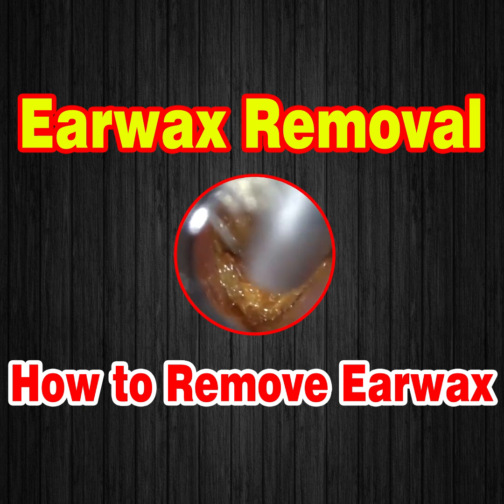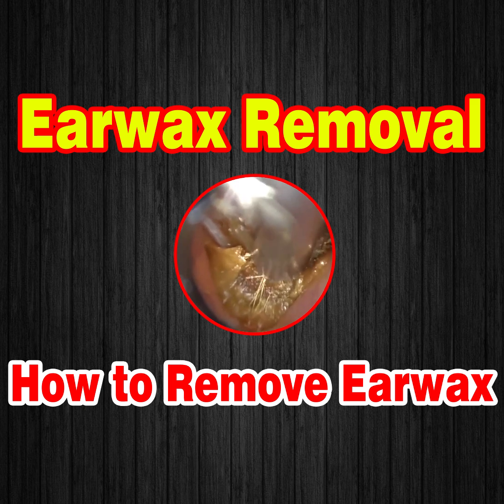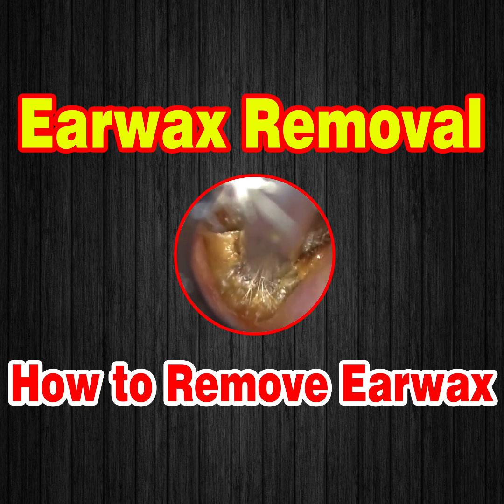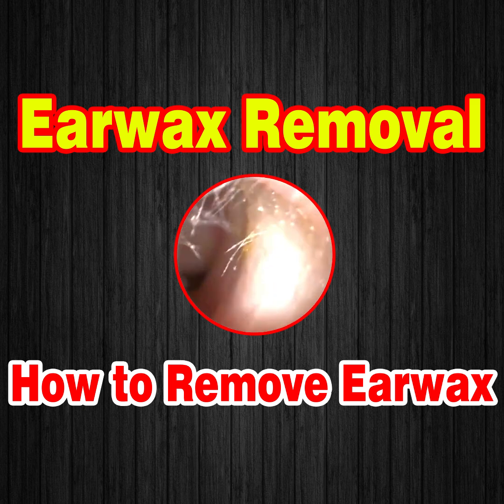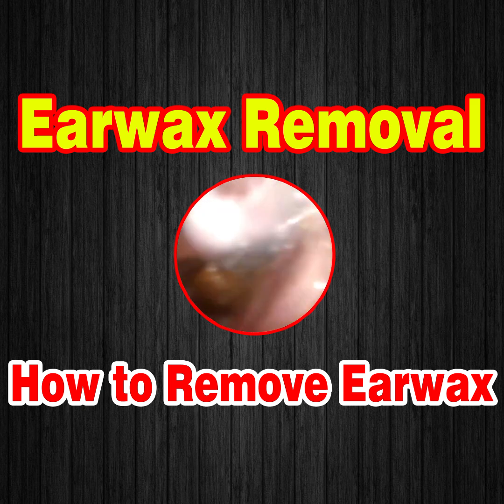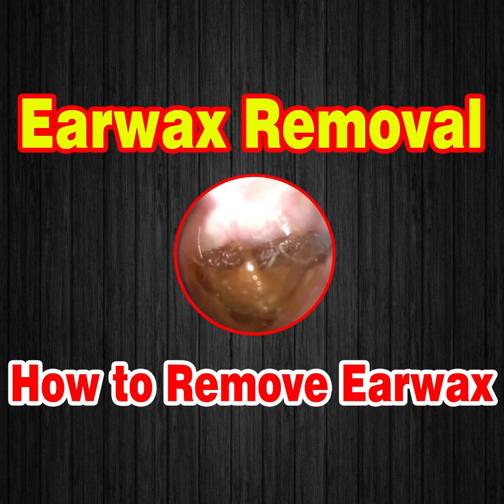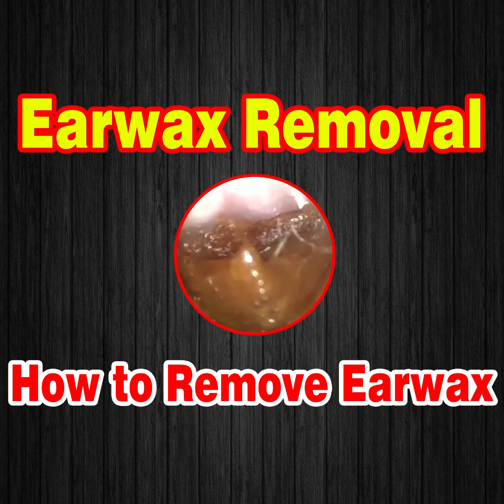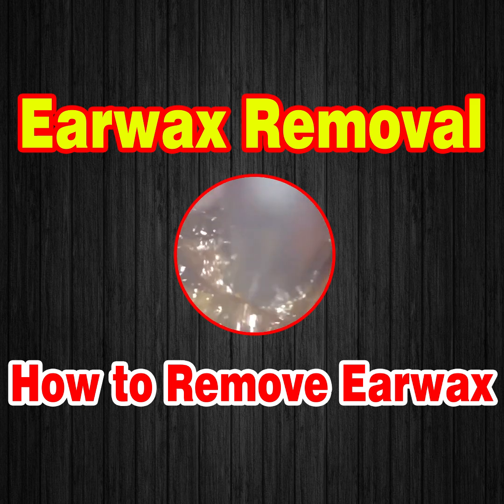With the cartilage portion where we are now, the outer third, the speculum should only fit up to the junction between the bone and cartilage, so about a third into the ear canal. If it goes any further into the ear, it's going to make contact with the bony part of the ear canal, and it can sometimes be a bit uncomfortable for the patient. Now, if the patient's asleep and you're doing surgery, of course you can push it a little further because they're not going to feel it. But when a patient is awake, like in this case, the speculum shouldn't really protrude beyond the cartilage portion of the ear canal. It should just reside on the cartilage portion, shouldn't really make contact with the bony part.